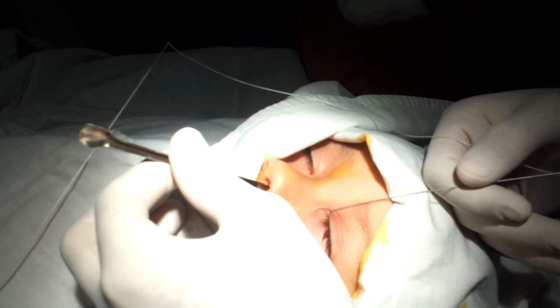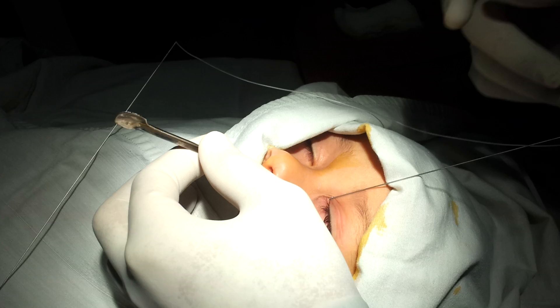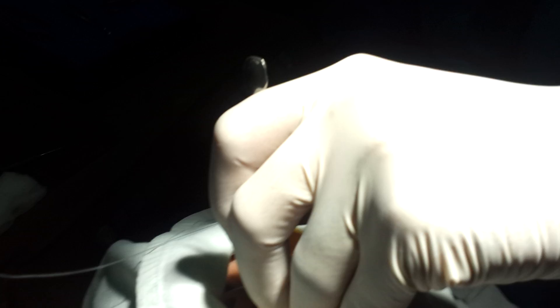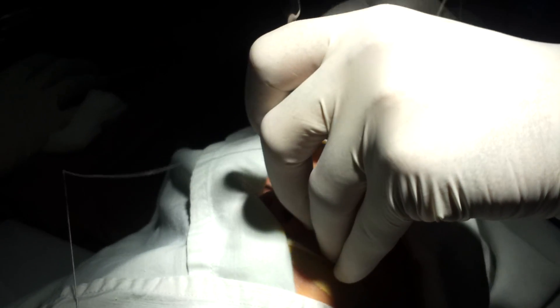What we do is — you don't go like this. Everybody thinks that they should go like this and look for the wire. You are supposed to look for the wire downwards and lateral, and here we are, clicking against each other.